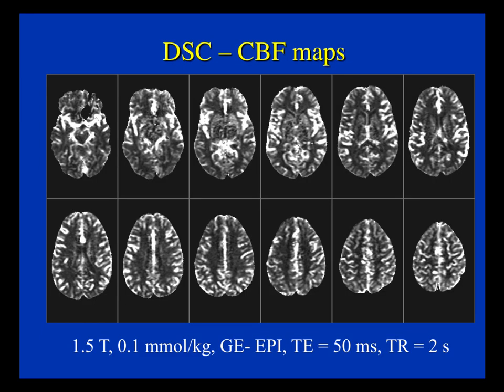And here's an example of a subject without any pathologies. Here you could see the gray matter perfusion is higher than the white matter perfusion. And we could see the perfusion across multiple slices is quite homogeneous in gray matter and white matter. Something to note in these types of images is the very high signal intensity in the blood vessels. Here is the middle cerebral artery. This high signal intensity in the blood vessels can sometimes mask the small pathologies near those blood vessels. So that's something we need to watch out for when you look at these images.